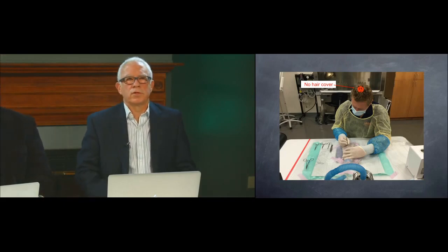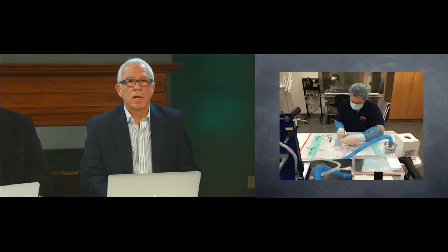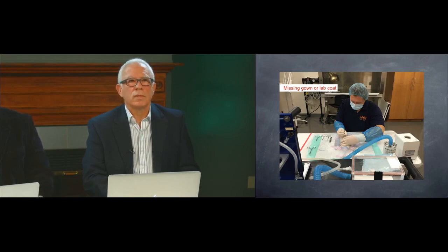What's wrong with this picture? Again, it may be obvious to you, but I see it all the time with our investigators. Look at that. Do you know what the problem is? He's not using a gown or a lab coat. Okay, so we'll continue into the next one.